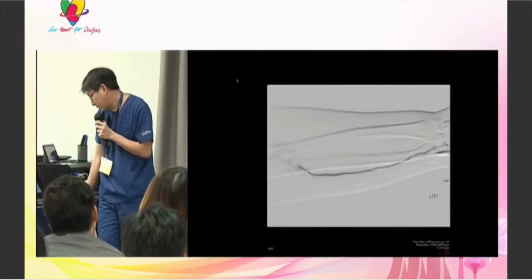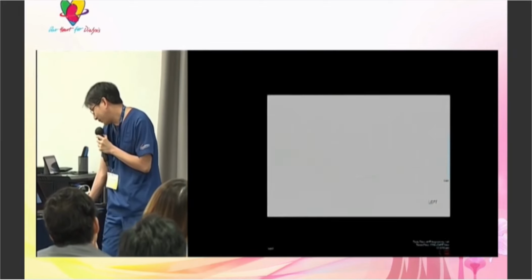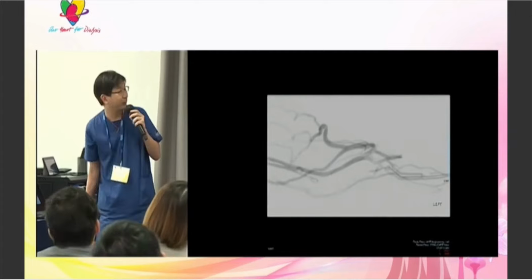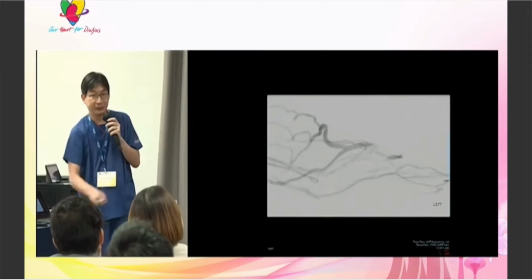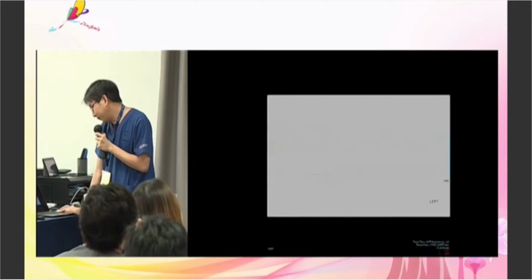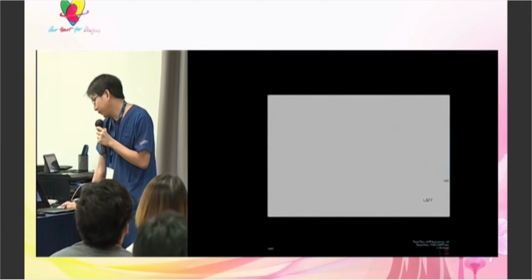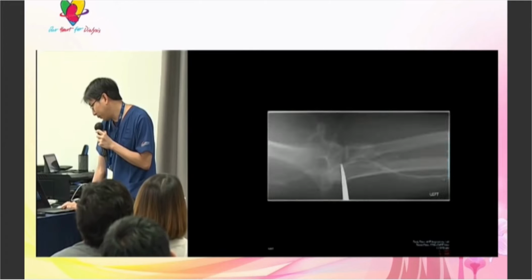So coming up the artery this time. So we found our way into the cephalic, but look at that. That is not really a cephalic. That's the problem. Instead of a cephalic vein, she's got these little tiny twigs coming off. And so I didn't really know what to do. So I just ballooned up with the usual balloon. There's a waist there. Tried to get it a bit better, but everything's going out the basilic.